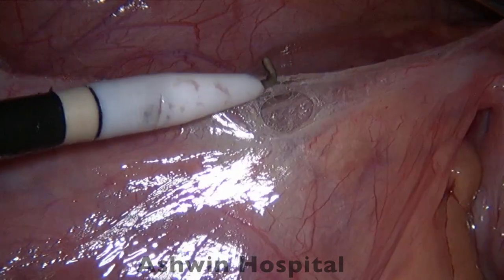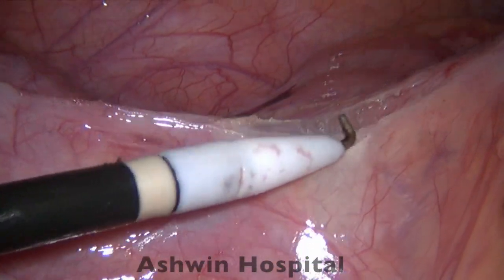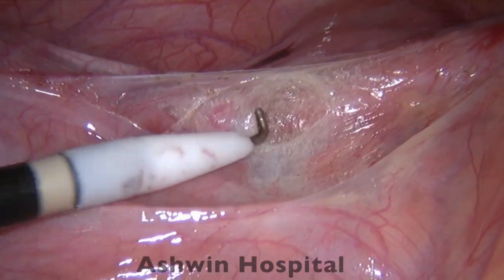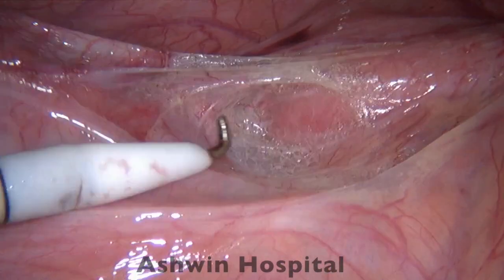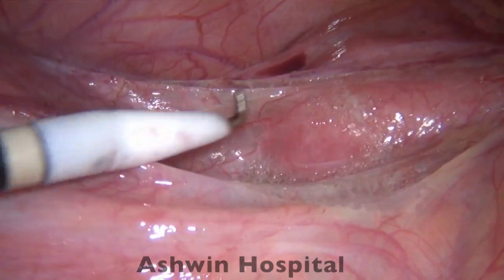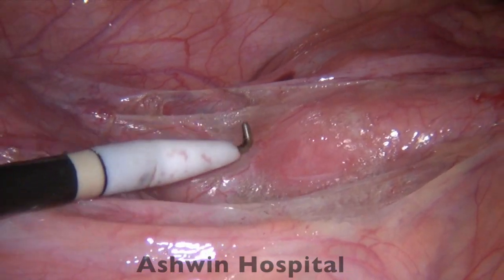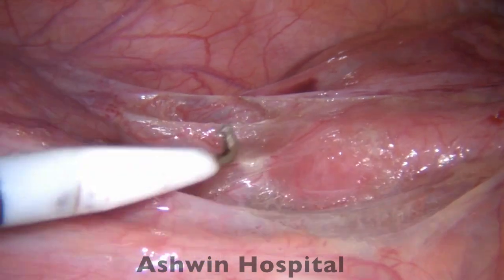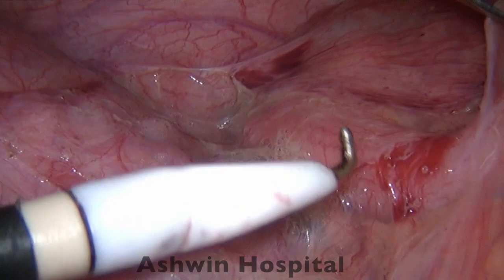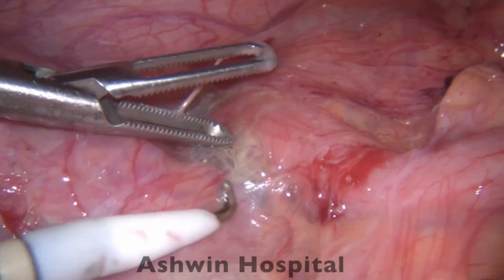With short bursts of cautery, the carbon dioxide automatically opens up and guides us in the direction we need to dissect. You can see the nice plane which is completely avascular and can easily be opened with good traction and counter-traction. The appendix is now slowly coming into our vision.